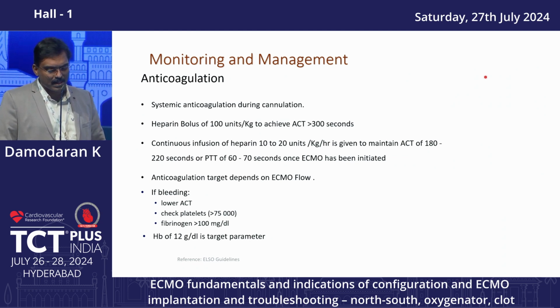Now coming to the monitoring and management, this is very simple: whenever you are starting the ECMO, you have to give a full anticoagulation, almost the ACT should be more than 300. Our practice is the first day we usually monitor with the ACT, with the maintenance ACT of 180 to 220. These are all from ELSO guidelines. You all know that. And also you should watch for bleeding. You should check for the hematocrit as well as platelets.